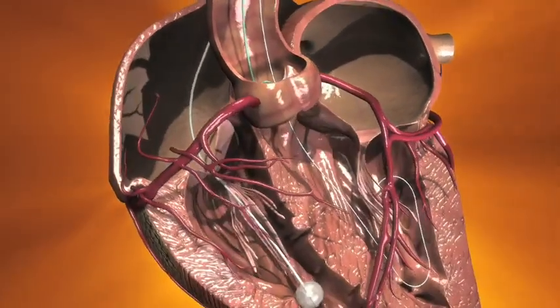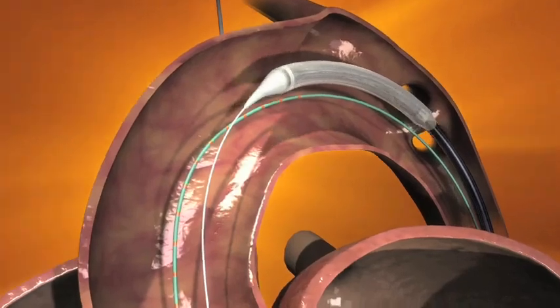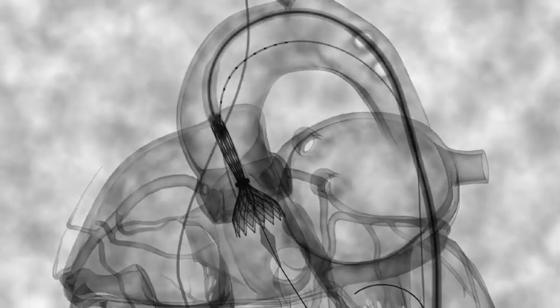Load the Medtronic CoreValve system onto the 035 super stiff guide wire and advance to target position. Use the micro knob to begin the initial deployment of the bioprosthesis. During the deployment process, various angiograms should be taken to ensure proper valve placement.